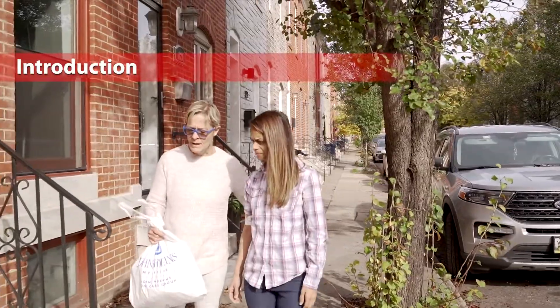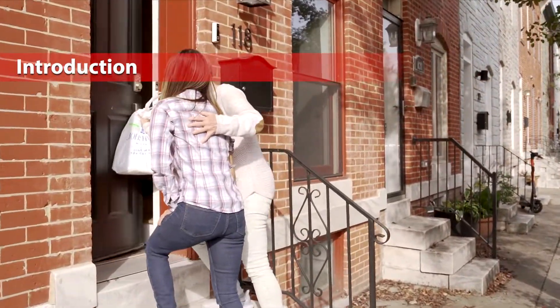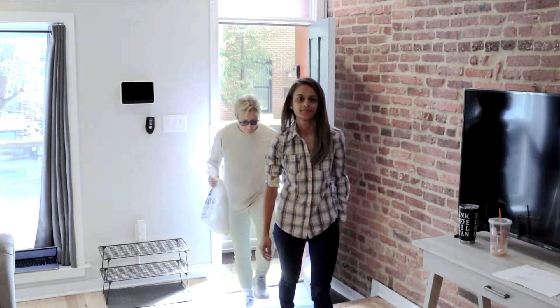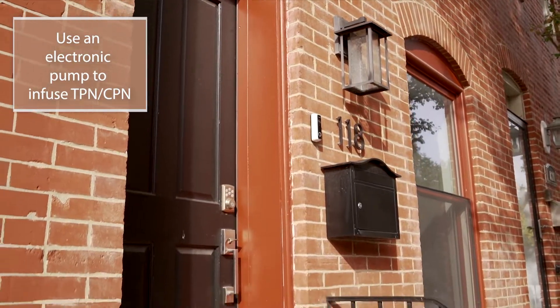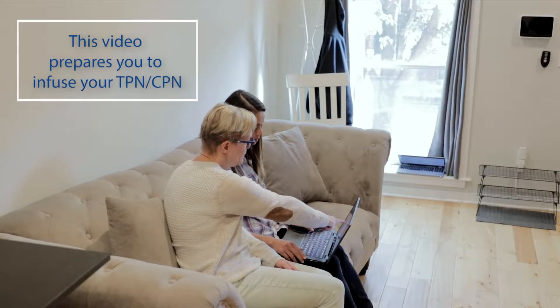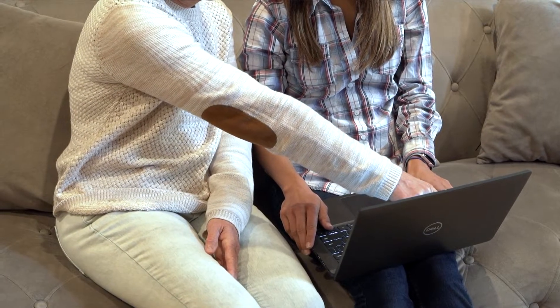Your medical provider has recommended that you receive nutrition, or total parenteral nutrition, also called TPN, through your IV or intravenous catheter at home. You will use an electronic pump to infuse the TPN until it is completed. This video will provide you with instructions on how to prepare and start your TPN. Your nurse or pharmacist will provide you with any special instructions.